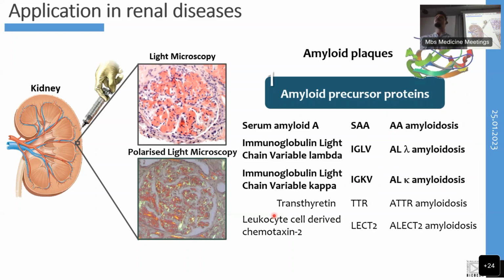And being able to distinguish the type of this precursor protein, of course, has some quite important diagnostic and prognostic relevance, which is why more frequently highly specific MS-based approaches have been used to be able to define the type of precursor protein that's present within these type of patients.